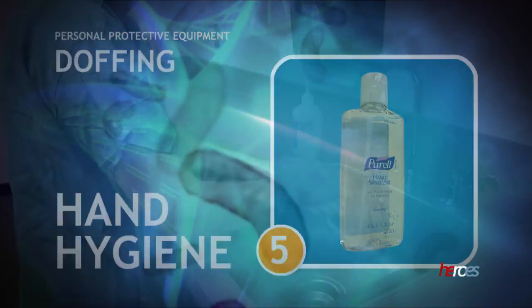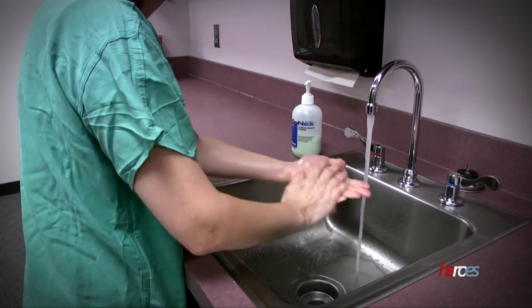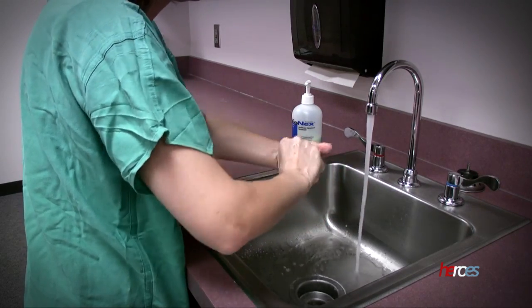Finally, perform good hand hygiene immediately after removing all of your personal protective equipment.